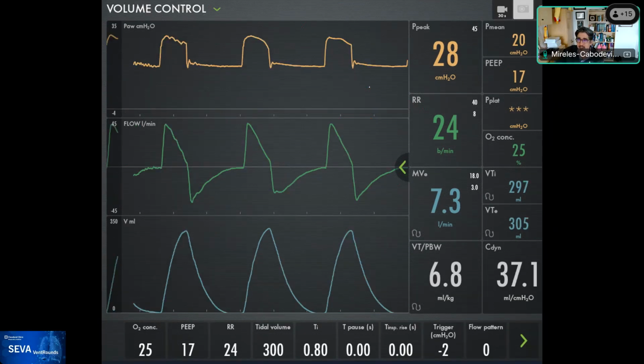There was a puddle of water on the inspiratory limb, just after the humidifier, and I lifted it up, and the fluid fell into the chamber, which is a no-no. Sherry, do you want to explain what I did wrong there, please? But you can see that they disappeared completely. So it was definitely fluid in the chamber.